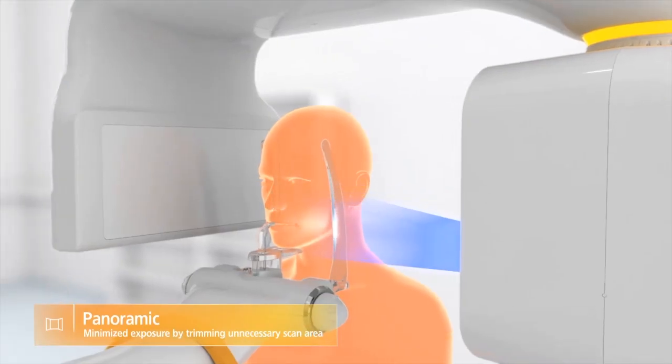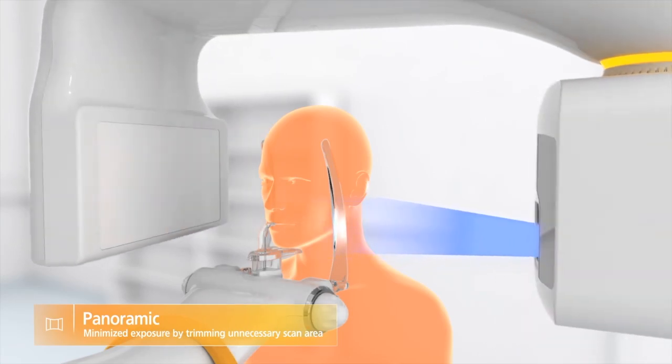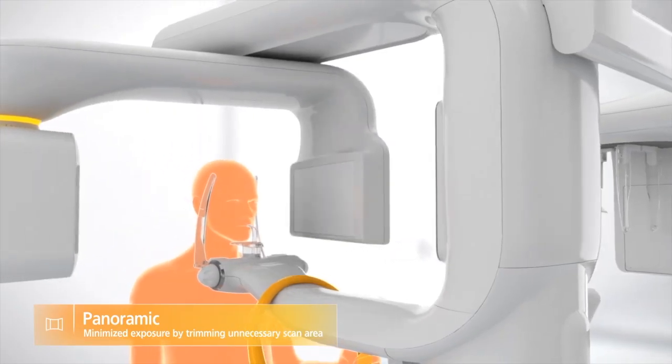Both 2D and 3D modes allow for minimal exposure by trimming the scanned area.